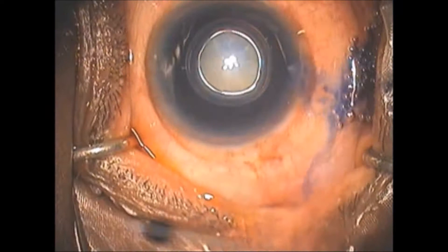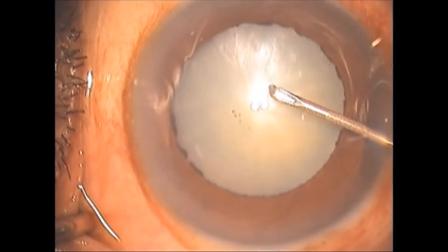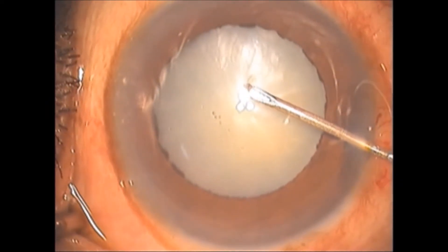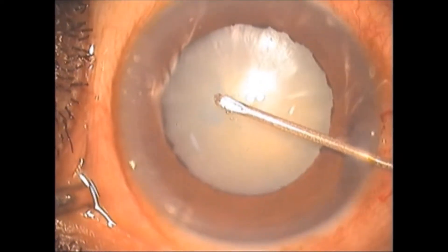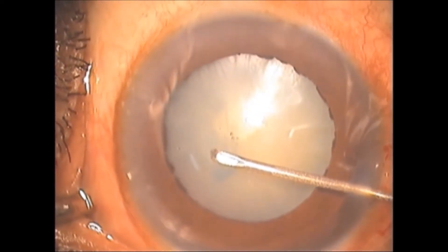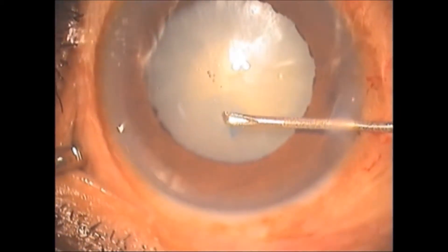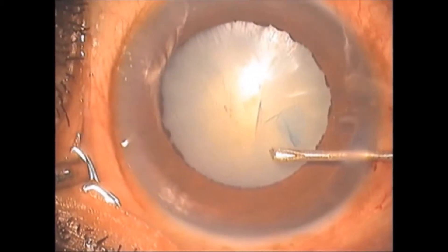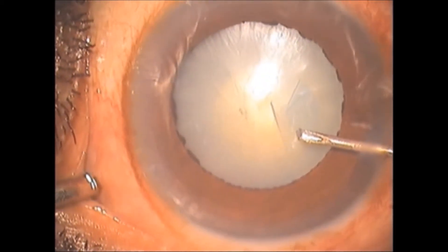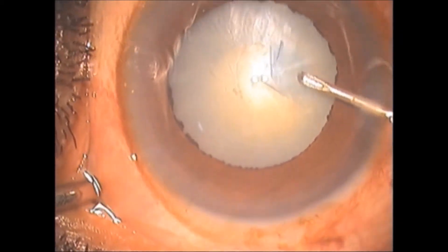Capsule management is an essential step, as a successful capsulorexis alone can help the surgeon perform phaco. Though FEMTOLASER assures good rhexis, its cost limits its usage. This video shows how inadequate staining of the anterior lens capsule by the surgeon makes capsulorexis difficult.